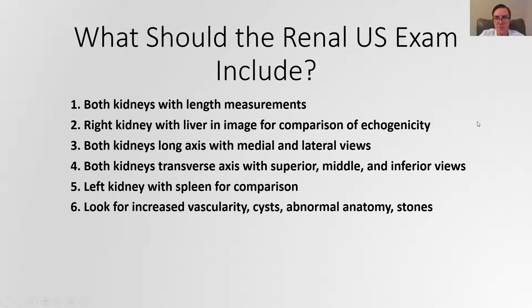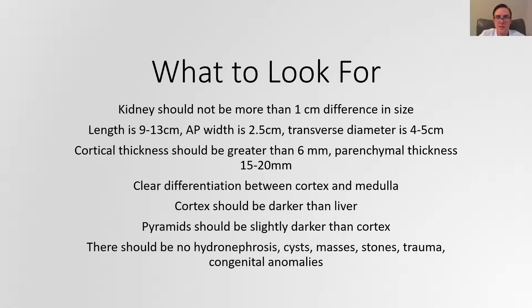You're also looking for a variety of abnormalities: increased or decreased vascularity, cysts, abnormal anatomy, or stones. The kidneys should be about the same size — no more than about one centimeter difference in any dimension. The length should be about 9 to 13 centimeters, while the AP width or front-to-back dimension should be about 2.5 centimeters, and the transverse diameter should be about 4 to 5 centimeters. Much bigger or smaller than that and you start to worry. The other important thing is measuring the cortical thickness and the parenchymal thickness.